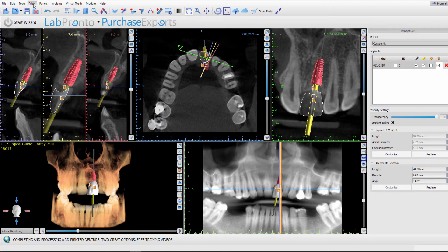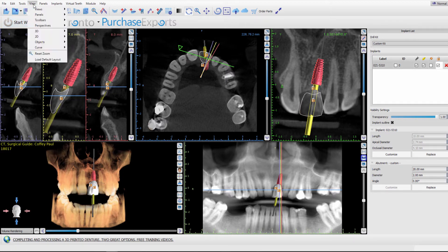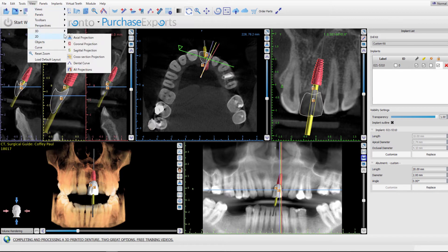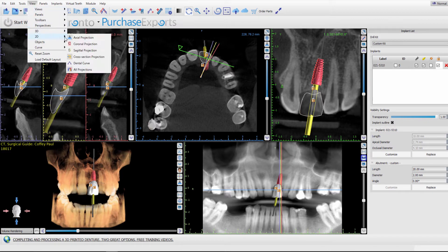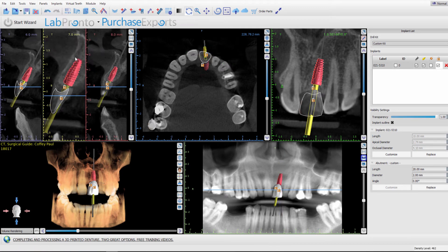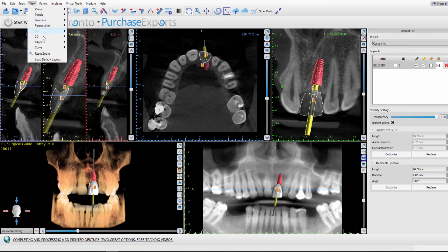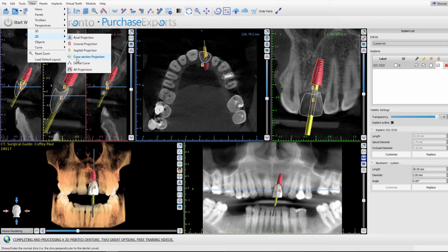First, go to View, then go to 2D. From there you can turn the closed section projection line off and you can turn it back on.